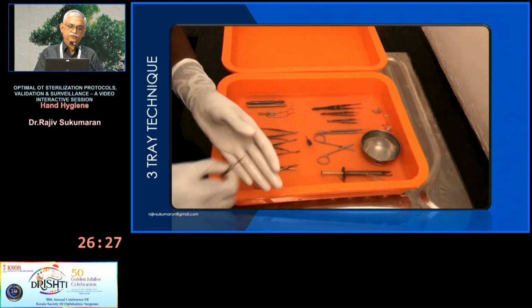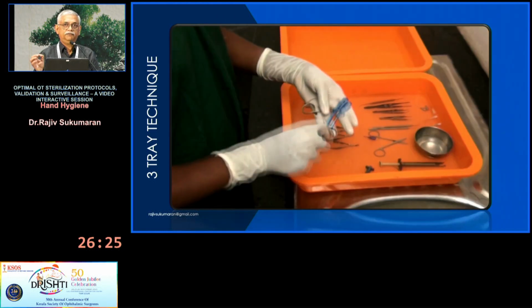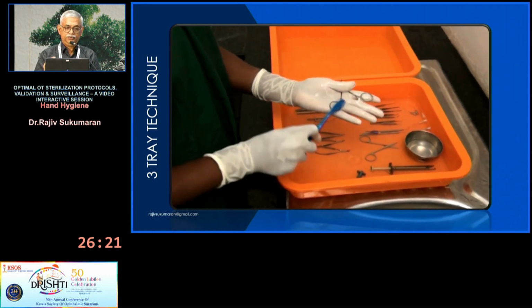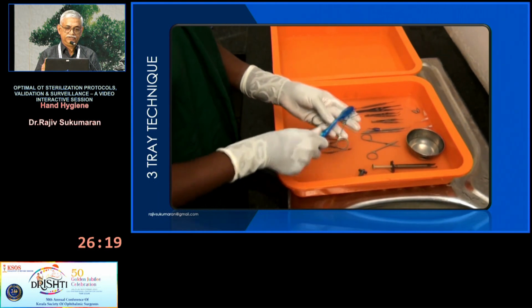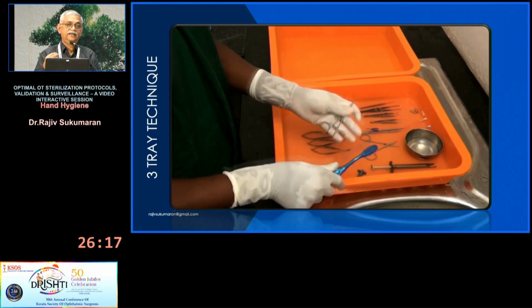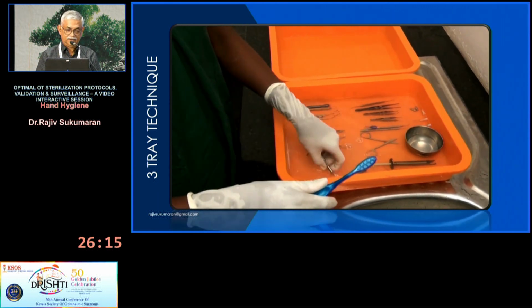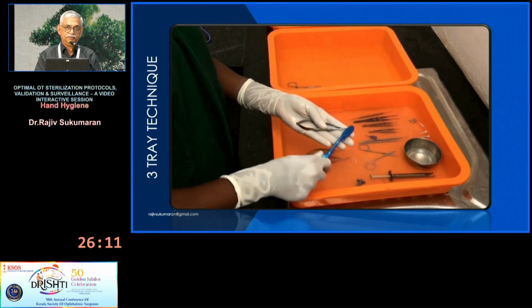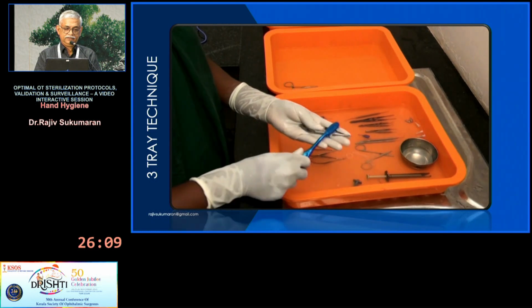After you soak it, use a soft toothbrush. And this is the wrong way of doing it. Don't do it outside the solution, because it's going to produce aerosolization, which is dangerous. This looks neat, but this is not the proper way of doing it.